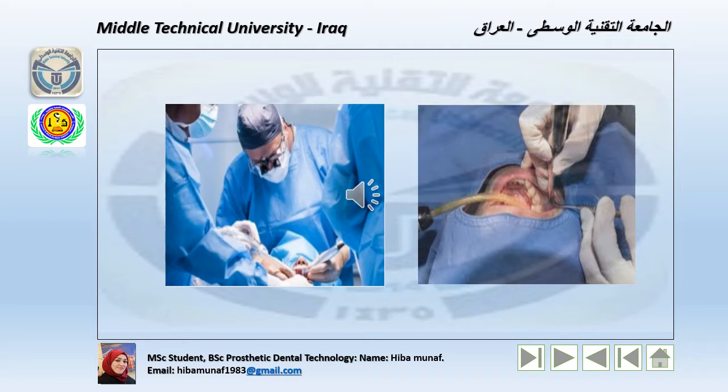in the jawbone. There are different approaches to placement of the dental implants after tooth extraction. Number one, two-stage surgery, delayed loading procedures. Number two, one-stage surgery, early loading procedures. Number three, direct flapless one-stage surgery.